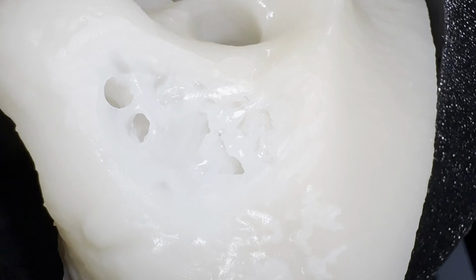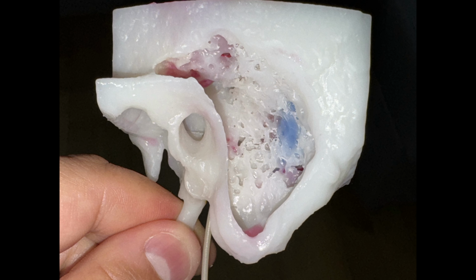Now, if you have access to a real temporal bone lab with suction and with irrigation, this is how it looks like being drilled. Looks pretty similar to the real deal. Even the resin dust looks like bone dust. And now for the final result. This is why you paint them, because you can see the blue and the red by transparency. And that's something to expect during real surgery, where you'll see the sigmoid sinus by transparency.